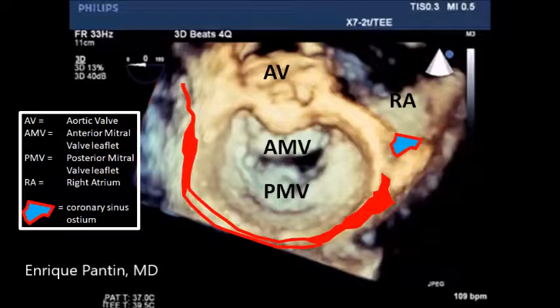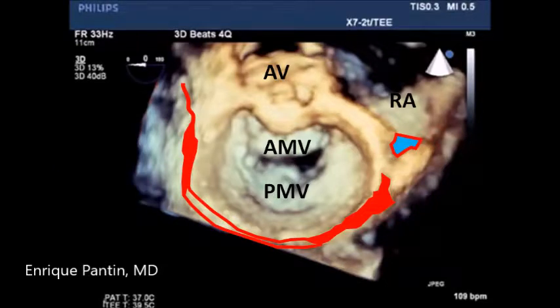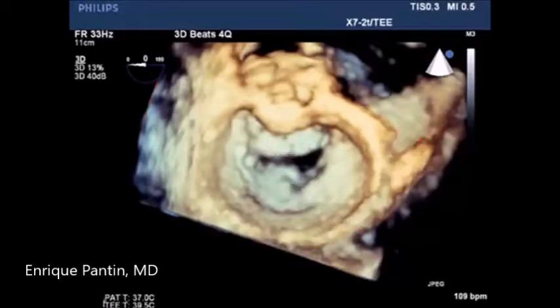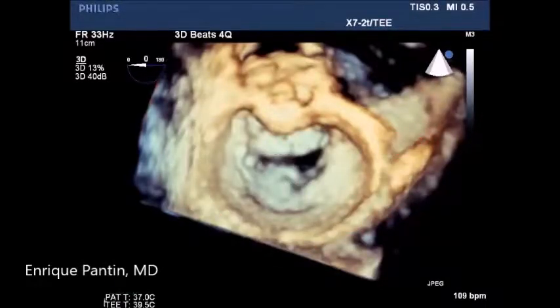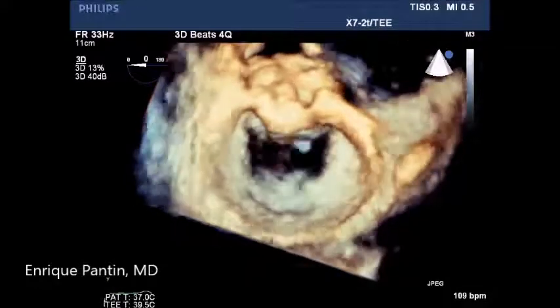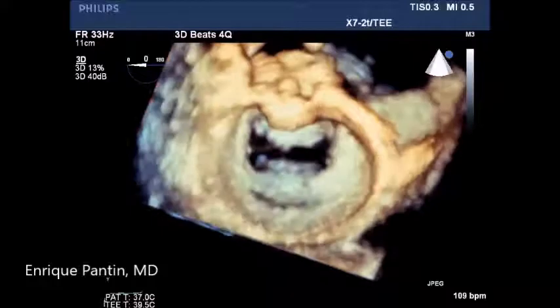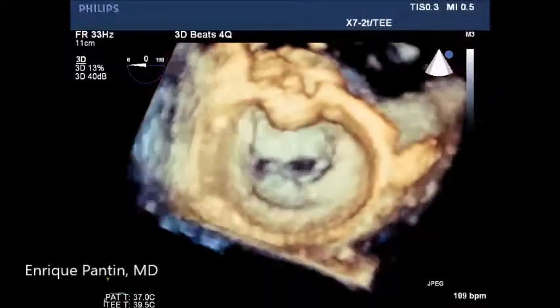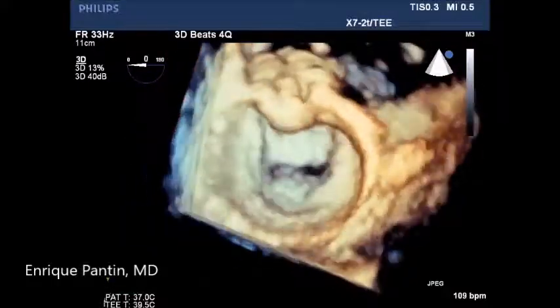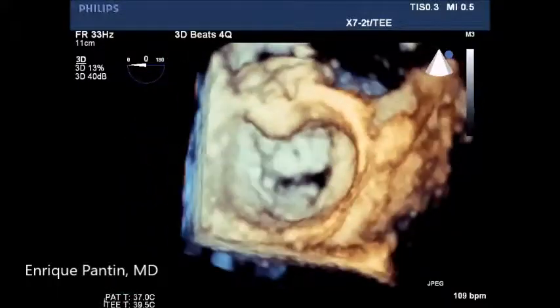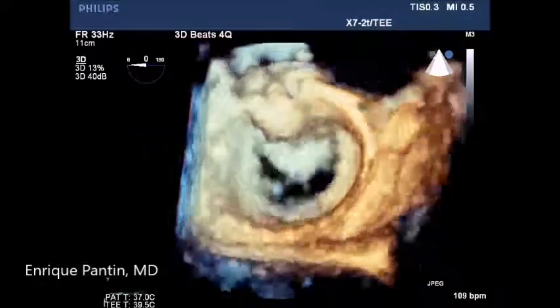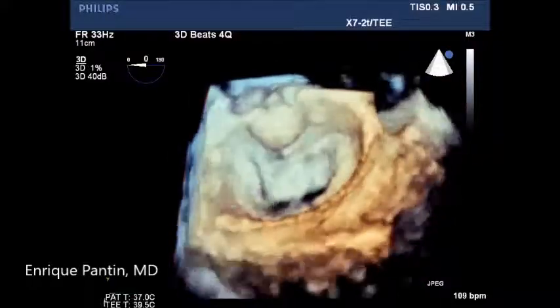The right atrium is to the right, and in blue with red, it's the ostium of the coronary sinus. The coronary sinus is depicted in red in the posterior aspect of the image. We will go through several images, rotating the image to try to get a better understanding of the anatomy of the coronary sinus.